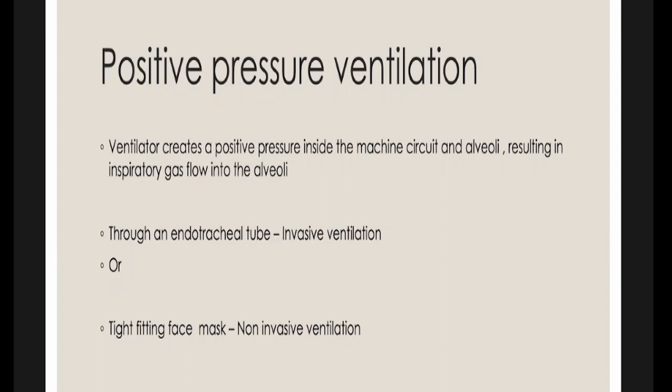All right, we need a tight fitting face mask, and a non-invasive ventilation strategy can be done with that. Okay, so that is how it is. So if you use a tight fitting mask, that is known as a non-invasive ventilation strategy.